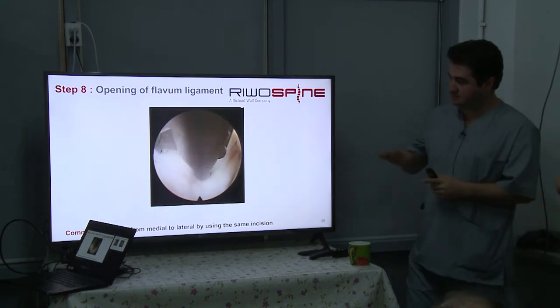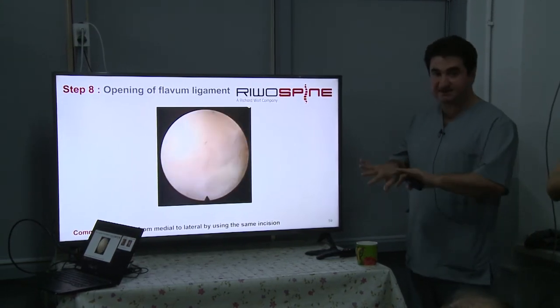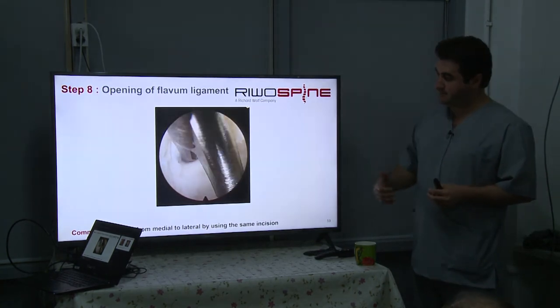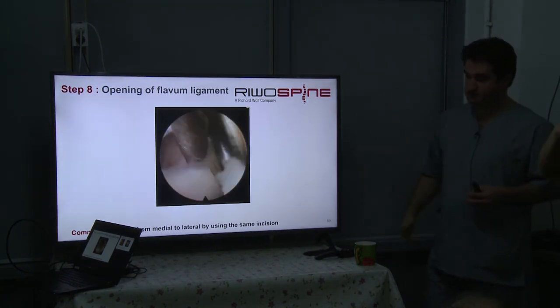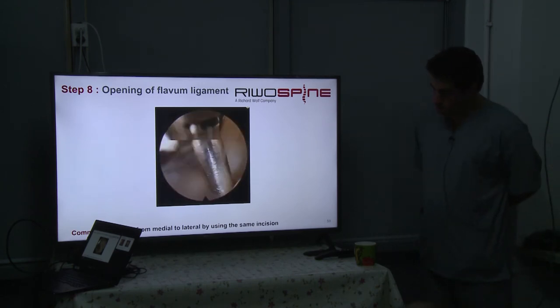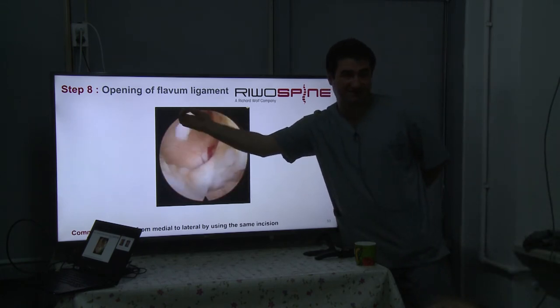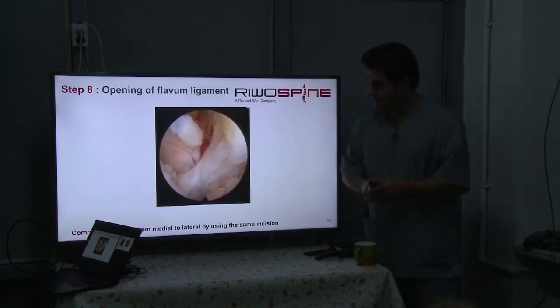How we do it again? Press a little bit down, and stretch the flavum always. We stretch the flavum, and then we cut. And then we find the epidural space. Then we put the back side of the scissor, then cut it to the lateral. Always medial to lateral. Otherwise, you can catch something here. Then you see the facet joint and the rest.